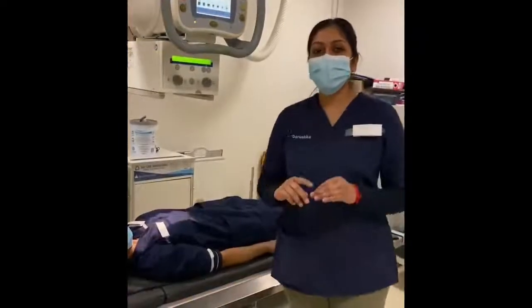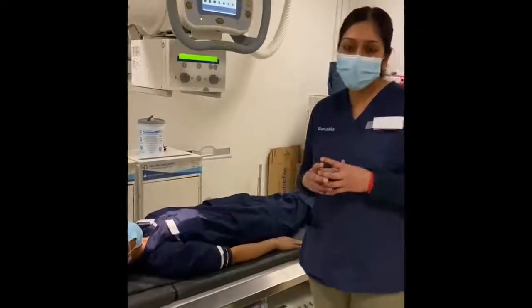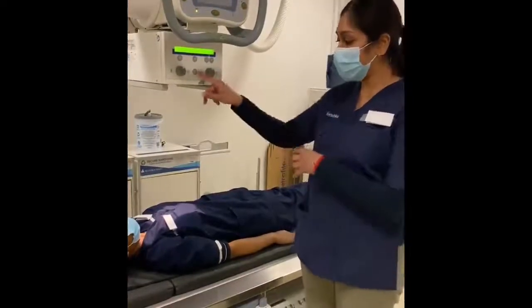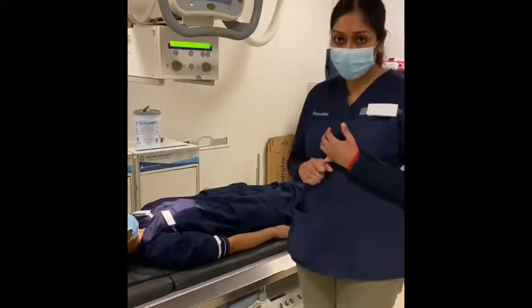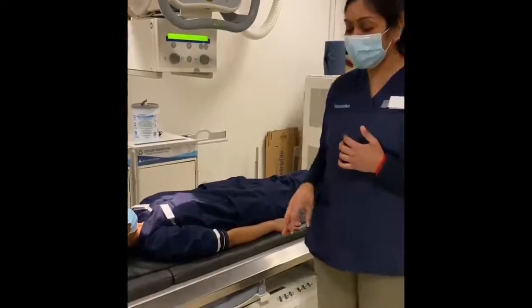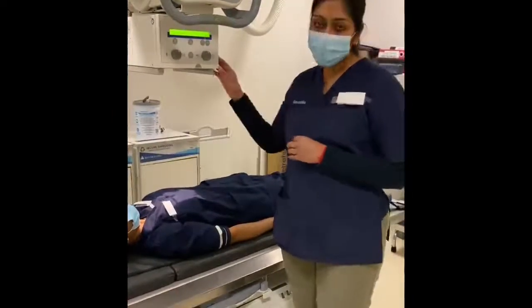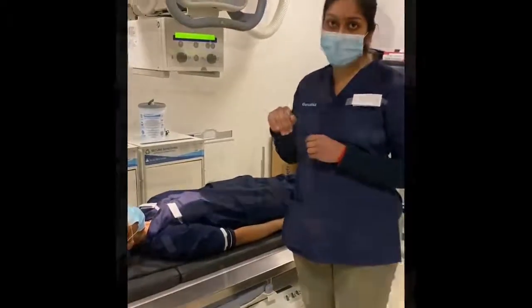Okay, so now we're going to move on to the T-spine lateral view. Most of the things that we mentioned for the T-spine AP view apply to the lateral as well. We're still going to use 100 FFD. We still need to make sure that our X-ray tube is aligned to our image receptor, and the direction of our beam is still the vertical direction.